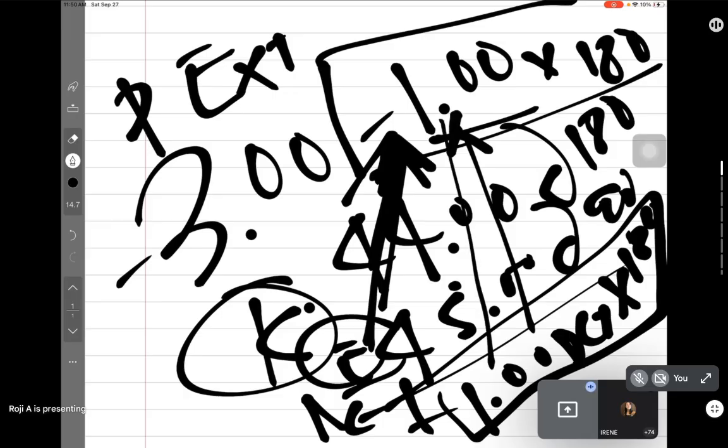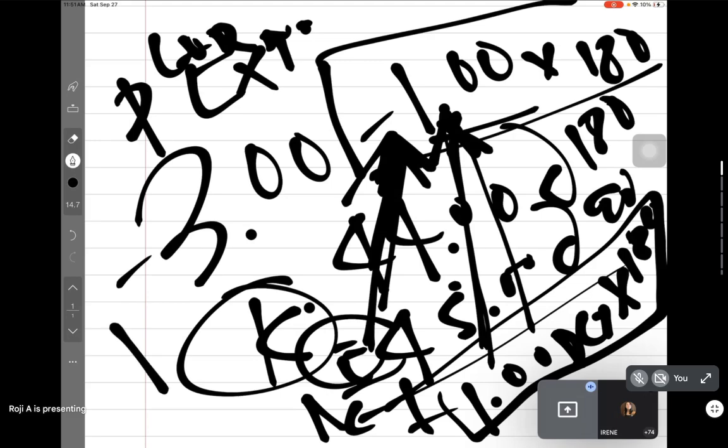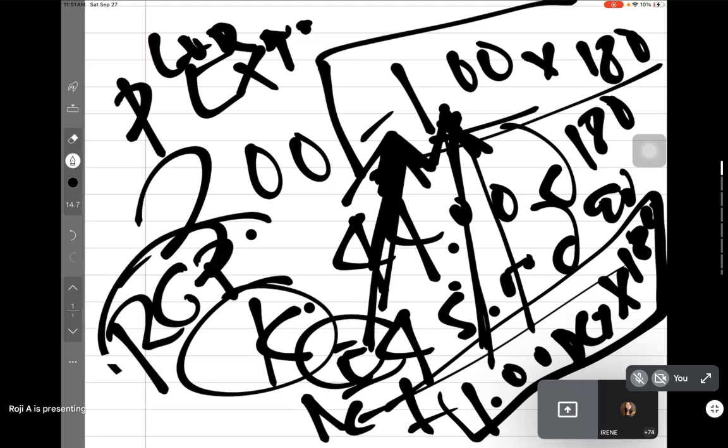As you can see, they are the same. Therefore, the astigmatism of the patient is purely corneal. Whenever it's purely corneal, the contact lens in mind would be RGP. Does that make sense now?